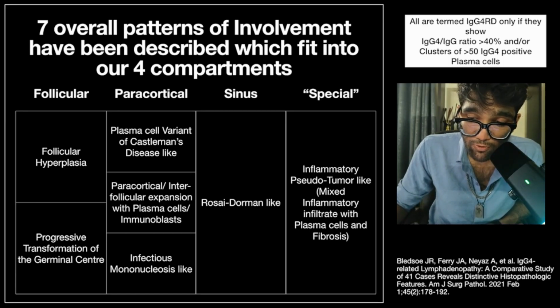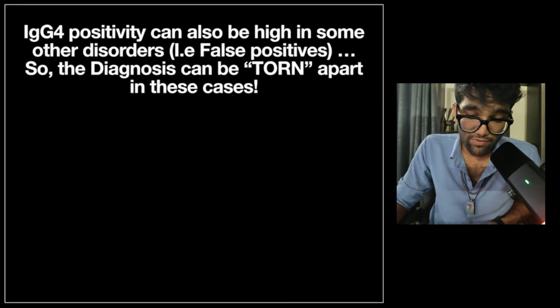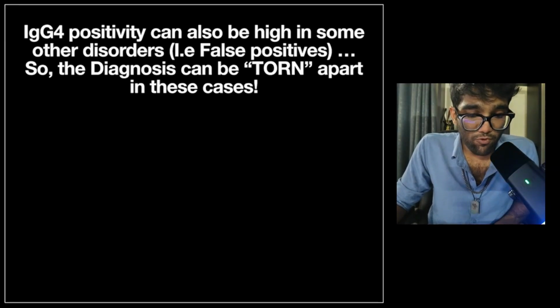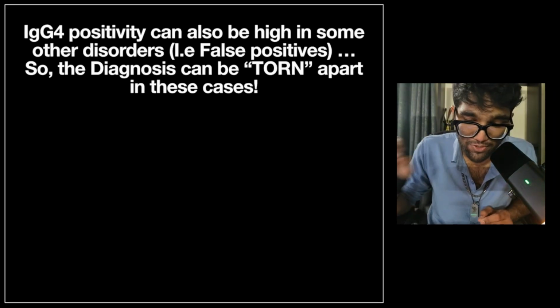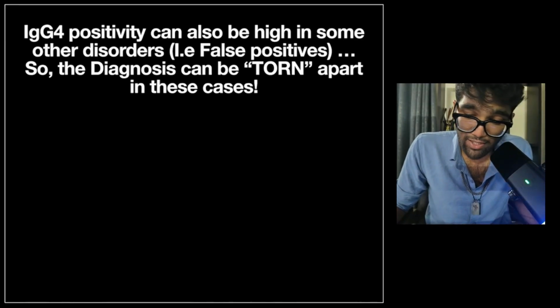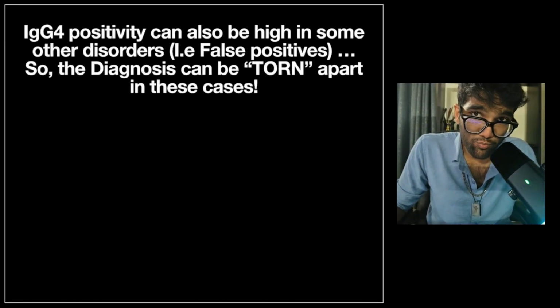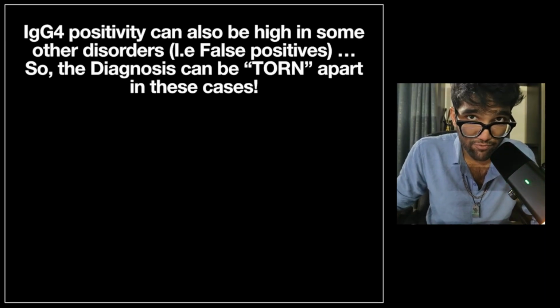Now, IgG4 IgG, although it is the defining feature of these biopsies, can be false positive in multiple cases, and in that case, essentially, if you've written a diagnosis on a piece of paper, you have to tear it apart. Therefore, IgG4 can be notoriously difficult to diagnose in lymph node biopsies.